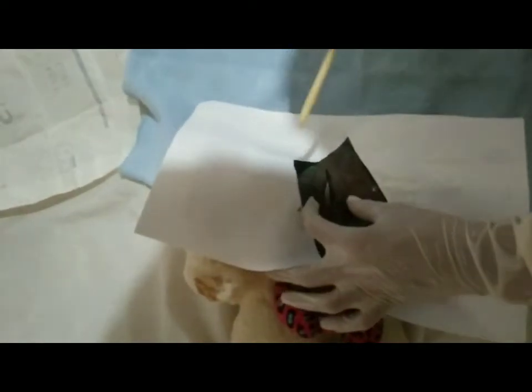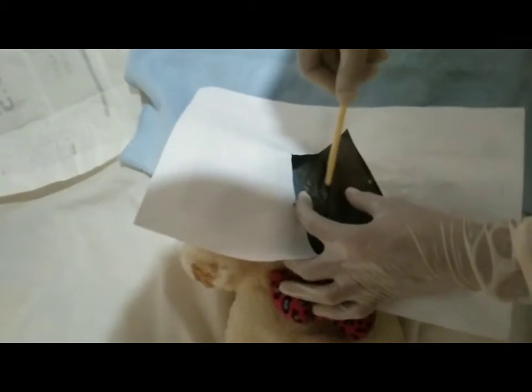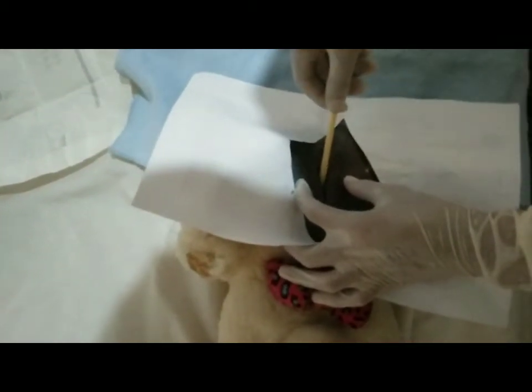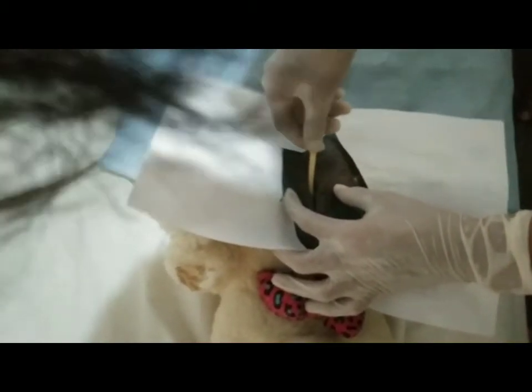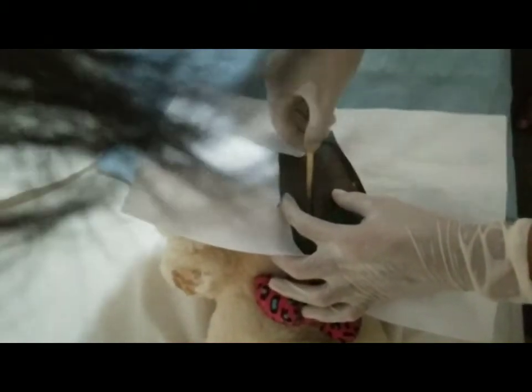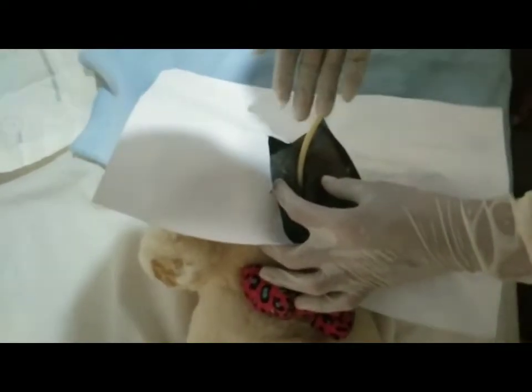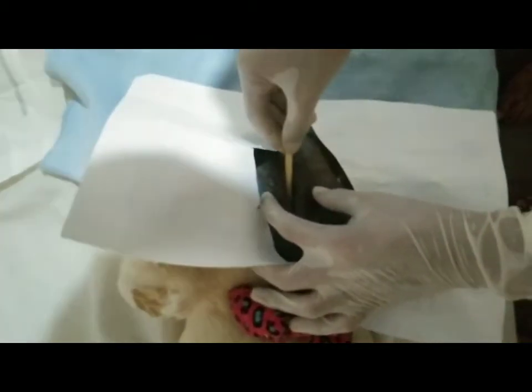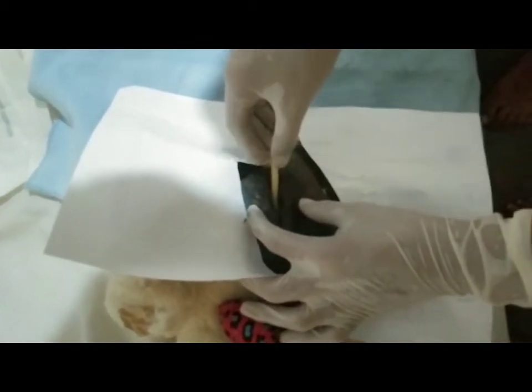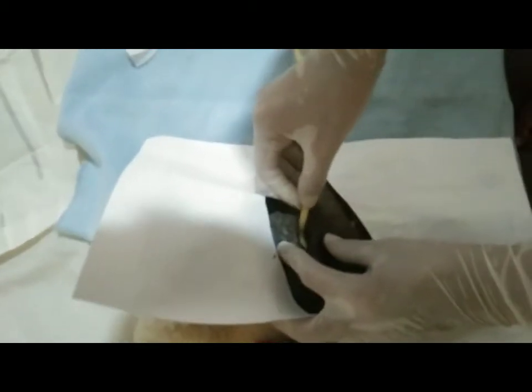So ma'am, can you please inhale and exhale for me? So okay, so gently insert the catheter to the urinary meatus of the patient. Okay, so assuming that you already, if you see the urine, and gently push it with 1 to 2 centimeter, 1 to 2.